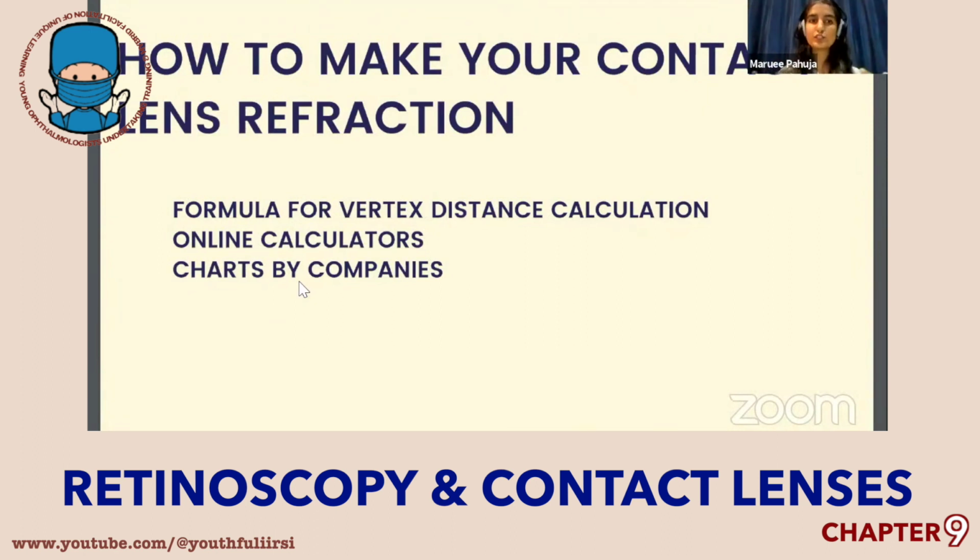Why is it that we change the prescription in a contact lens beyond -4 diopters? So the vertex distance from the spectacle plane to the corneal plane is different. It ranges anywhere between 12 mm to 20 mm. So now you have to make up for that vertex distance correction. Up to 4 diopters, it's almost like a 0.12 difference, and beyond that, it goes to a higher difference in the spectacle prescription versus the contact lens prescription. Therefore, it is really important that you do not give the same spectacle prescription order for your contact lenses.